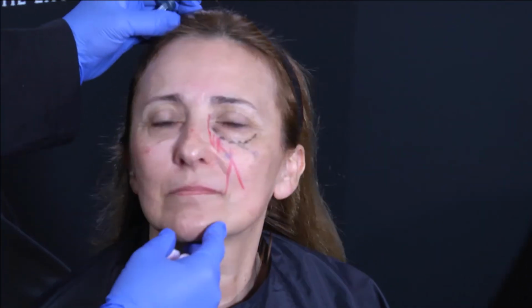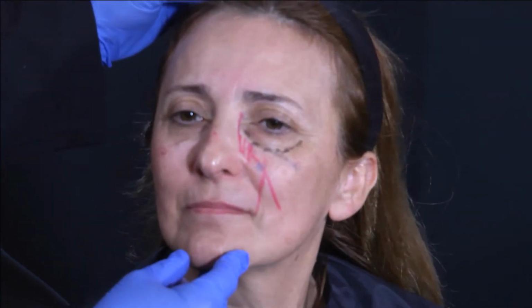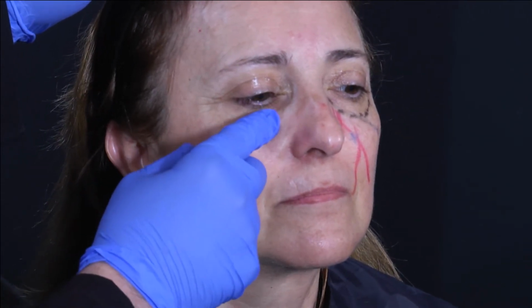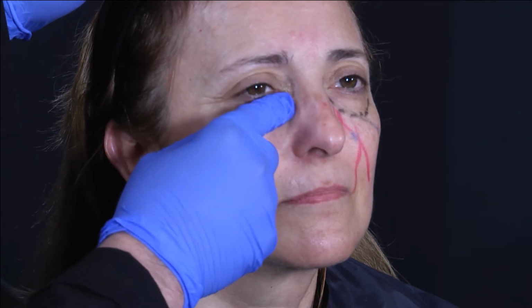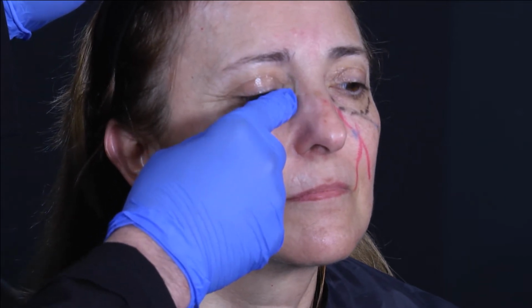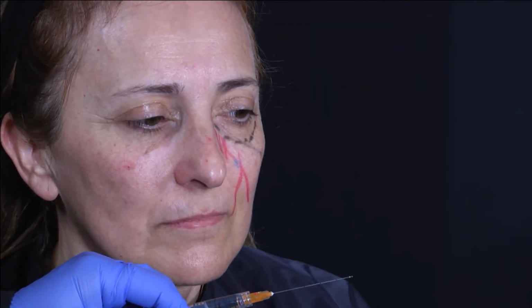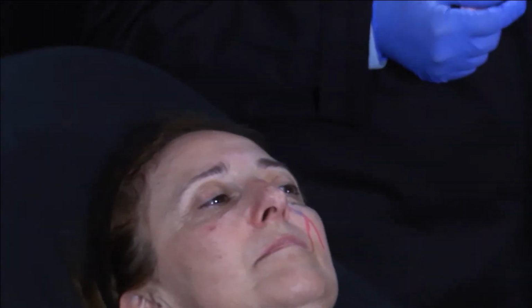So here you see one side here, and the other side, I feel all this area here, you see, until I reach the top of my tear trough here. Okay? Here, 0.4. So I try to put not a lot of product, but in the right place.